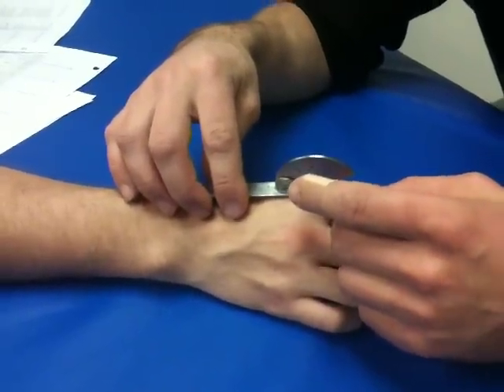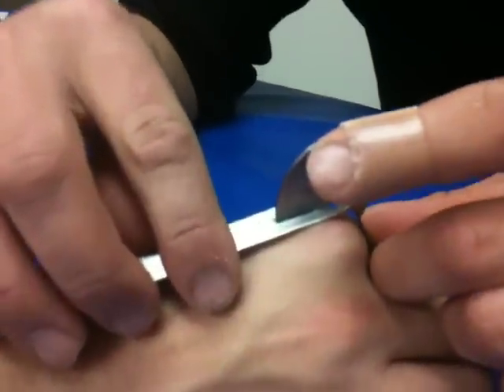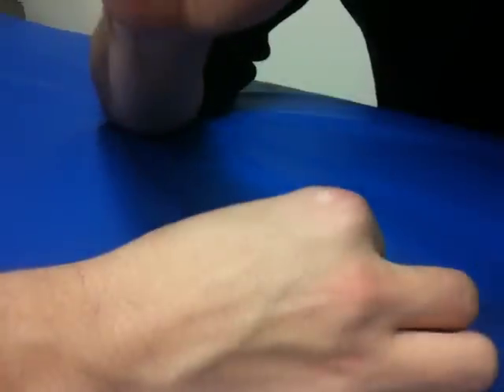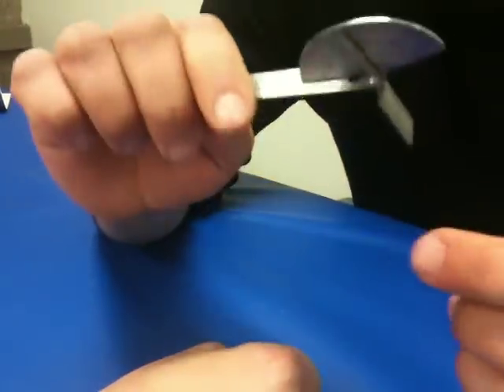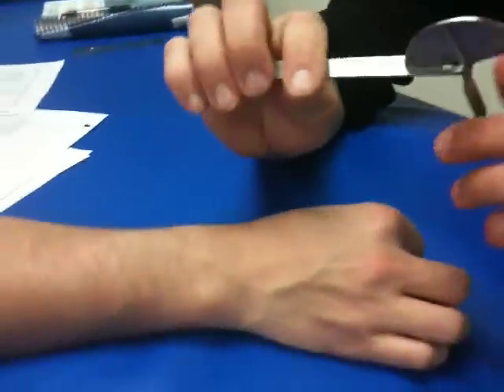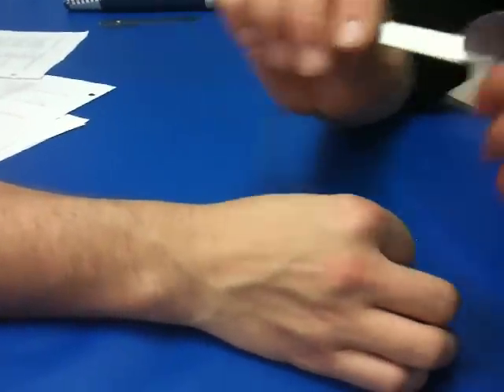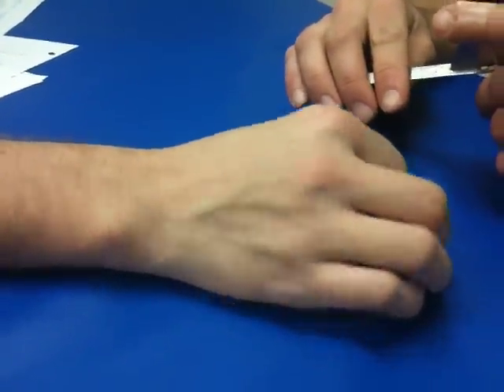So flex. You're basically trying to pull their thumb back into extension. Normal is 90 degrees — it's a little less than that, about 75 degrees. That was for the second MCP joint, and you'd repeat the same technique for the third, fourth, and fifth.